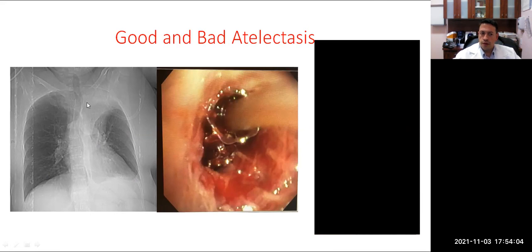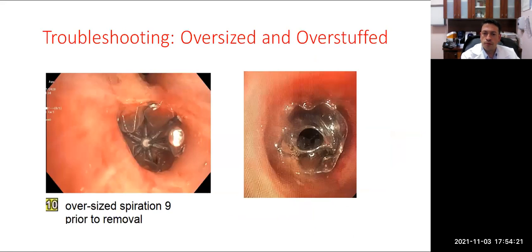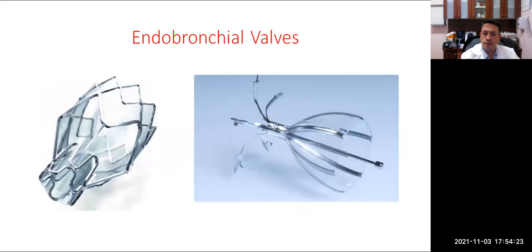Here, this to me looks like you do have left upper lobe atelectasis, but that left upper lobe is filled with something, mucus. Obviously this could be a tumor. So it doesn't have enough volume loss. The lobe is down, but it doesn't have the appearance.